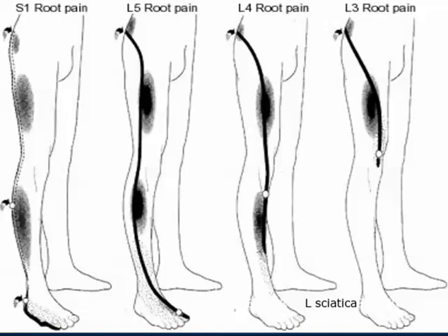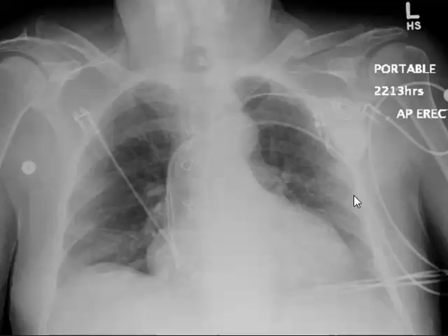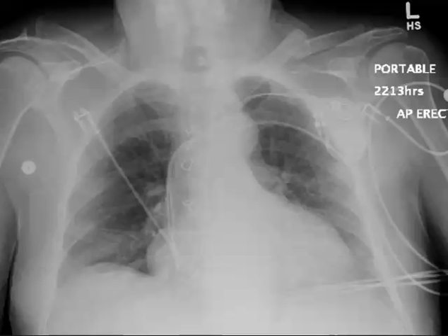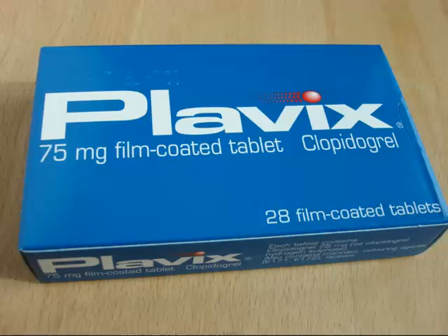This is his chest X-ray pre-op. I'm going to ask Alan to remember this because I'm going to show the post-op and ask what he thinks. He has a cardiac pacemaker. Pre-op he was okay breathing. You can see cardiomegaly, some fluid, and the pacemaker right there. Because of the pacemaker, we couldn't get an MRI.